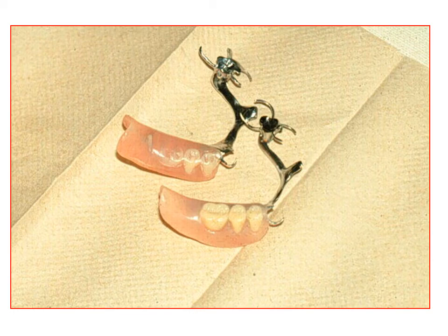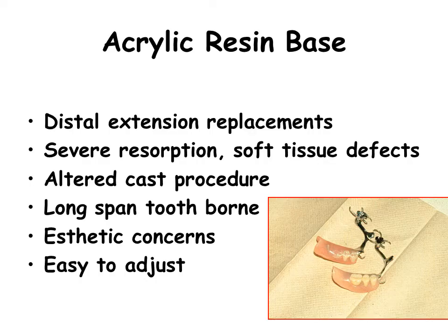Acrylic bases are also subject to a certain amount of distortion related to strain from curing. Acrylic is used in extension base cases, areas which require periodic relining, areas when aesthetics is important, large defects and long tooth-borne areas, in which some support from the soft tissue is needed. The big advantage: it is easy to adjust, repair, or replace.